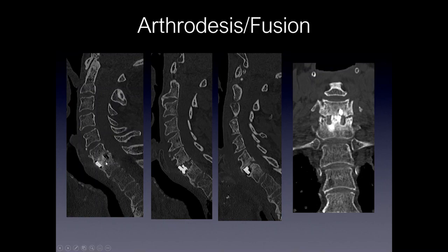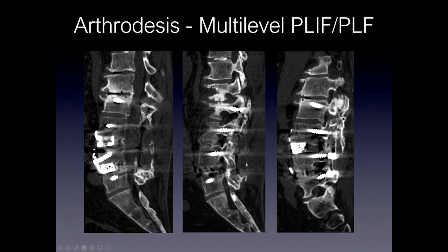Here's another example where on the sagittal you can clearly see bony bridging within the actual spacer. When you look lateral to the spacer, you don't see significant bony bridging, but centrally there's clear bony bridging — this would be considered fusion. Here's an example of multilevel posterior lumbar interbody fusion and posterior lumbar fusion. You can see continuity of bone across the disc space at these levels, and looking more laterally on the sagittal images you can see fusion along the facet joints as well.